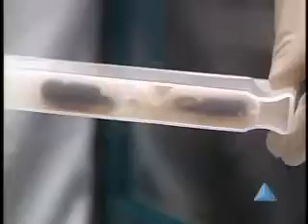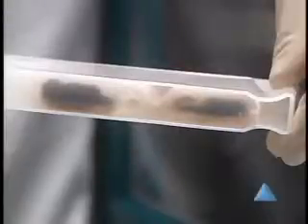Ready packs should be mixed to resuspend the solid phase reagent prior to loading into the reagent compartment. Once in the reagent compartment, the solid phase remains suspended due to the onboard mixing.